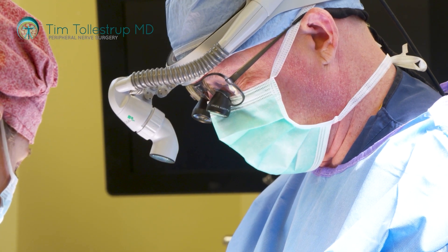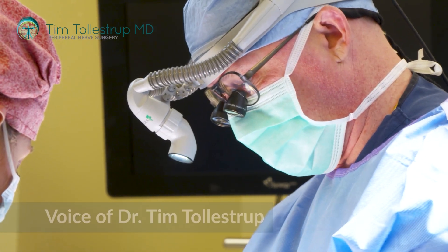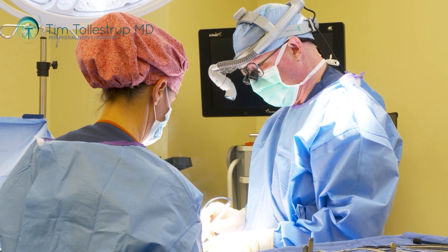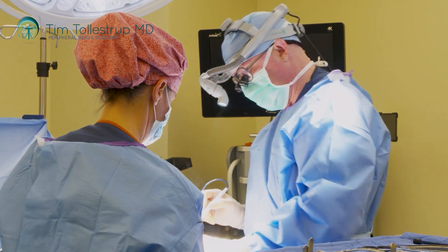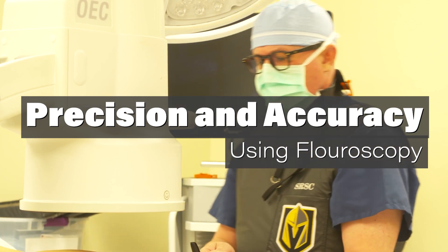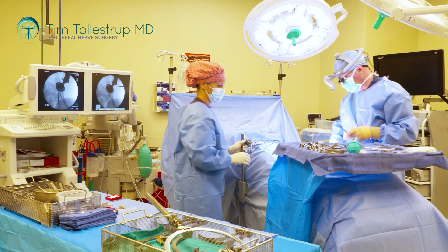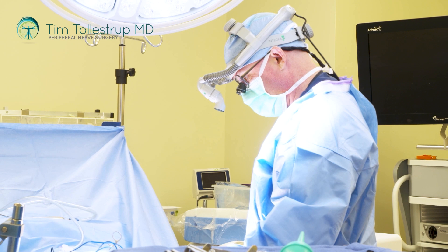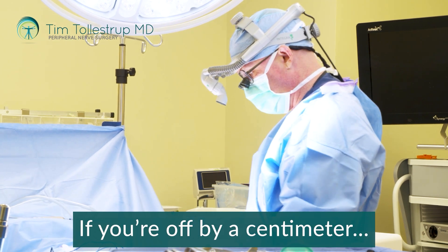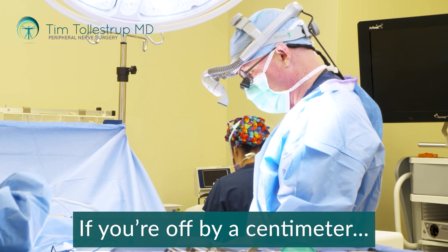One of the big parts of this operation is just getting down to the piriformis muscle, because it's basically right in the center of the pelvis. The size of the patient can really make this an easier or harder endeavor. What I use the fluoroscopy for is there are certain bony landmarks that will allow you to come straight down on the piriformis muscle every time. That's a key part of the operation — if you're off target even a centimeter or two, it can really make the operation a lot more difficult.